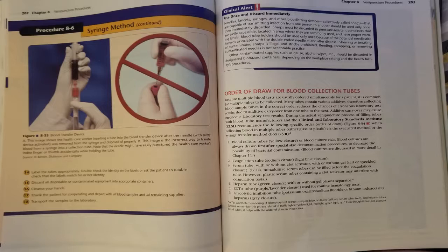Number 2, coagulation tube, or light blue closure. Number 3, serum tube, with or without clot activator, with or without gel, red or speckled closure. Glass non-additive serum tubes can be filled before the coagulation tube. However, plastic serum tubes containing a clot activator may interfere with coagulation tests.